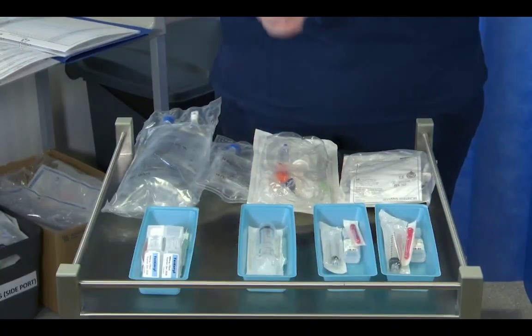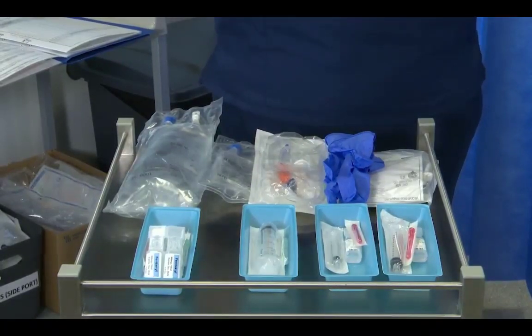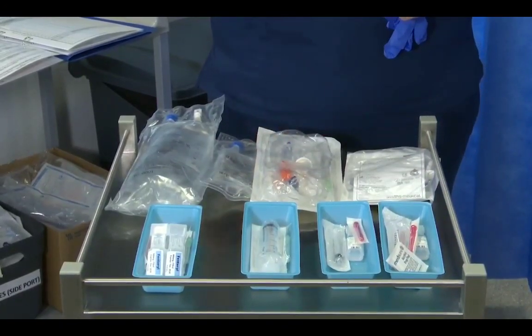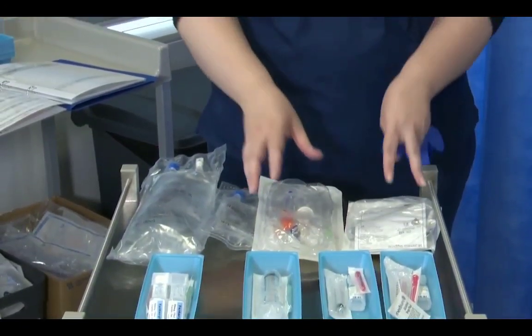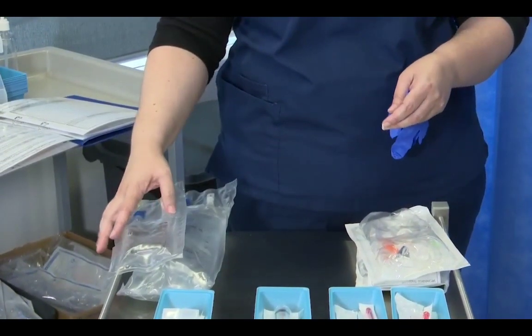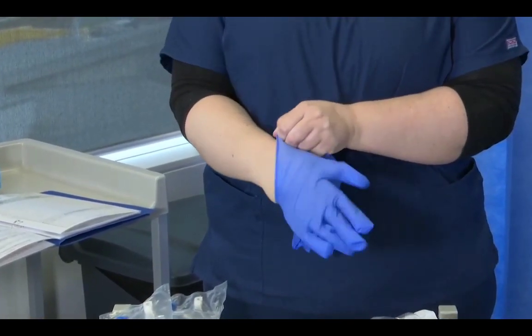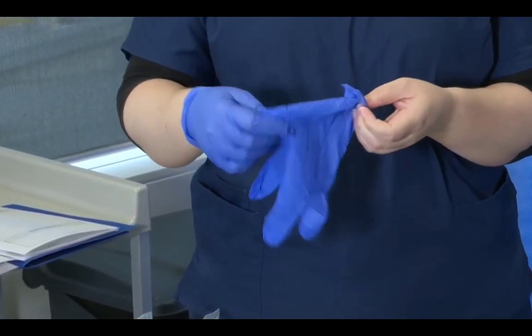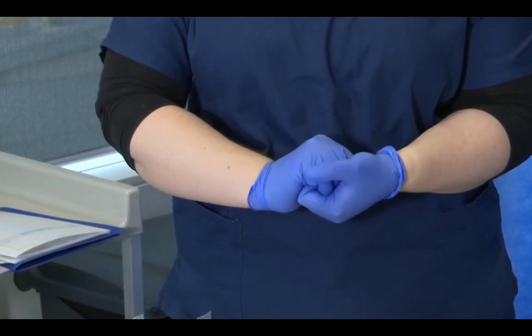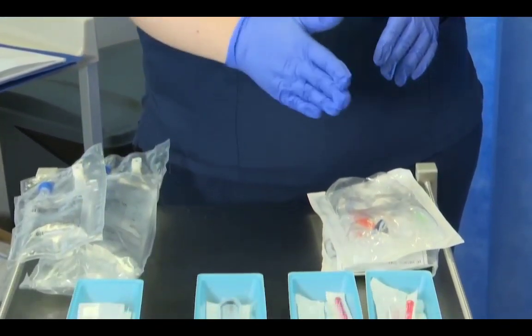The other things we're going to grab are a set of gloves, and we will also want some alcohol swabs for when we're swabbing our cannula. Now we're ready to start preparing everything. Making sure that you've got adequate space on your trolley to perform these tasks. I like to wear gloves to do this task. It helps me feel like I'm doing a clean task, but remembering that all of this is done through an aseptic non-touch technique as much as possible. So I like to go from side to side performing these tasks.